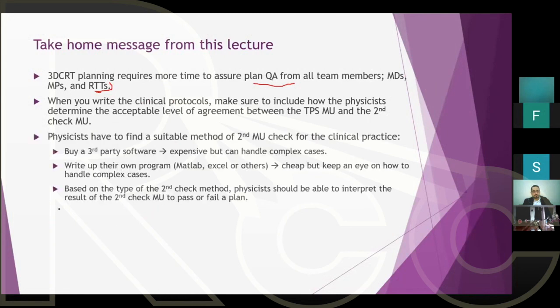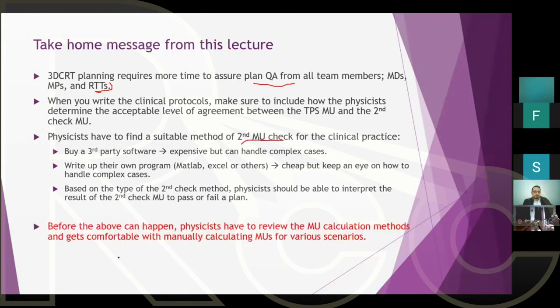And then, physicists have the daunting task, and really it is a very difficult task, because once you sign on that plan, then you're allowing the patient to go on for treatment. You have to make sure that the second check for the monitor unit is also performing properly.